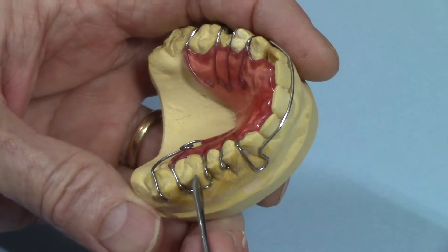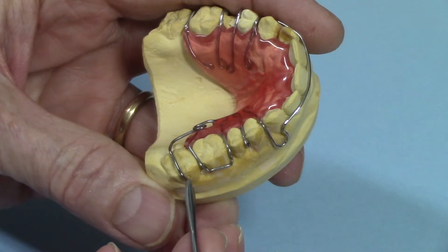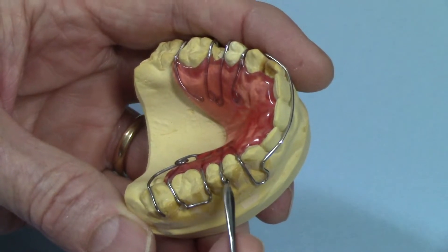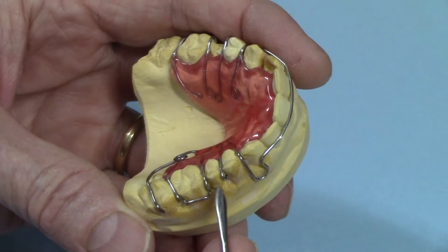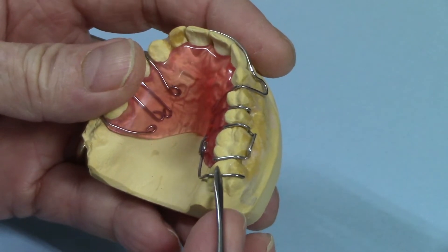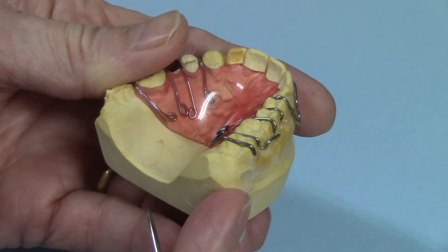Ideally I'd like to have a helix on both sides and have this titanium wire be continuous around with helixes on both sides, giving you that mousetrap spring action. But I couldn't figure out a good way to attach it to the buccal components over here since you can't solder or weld titanium, so I just did the one side.